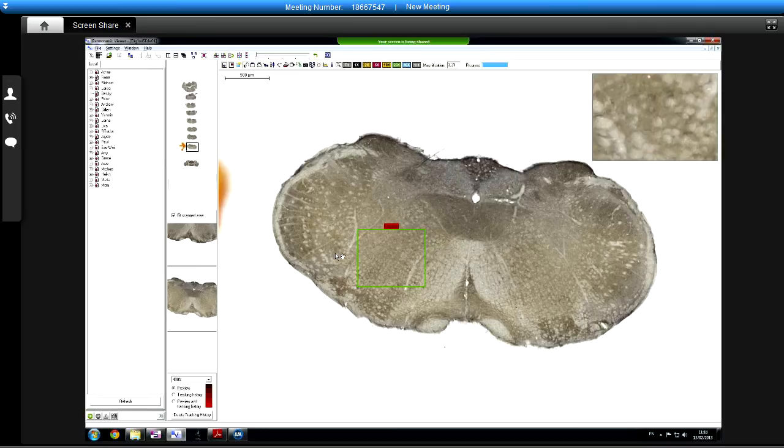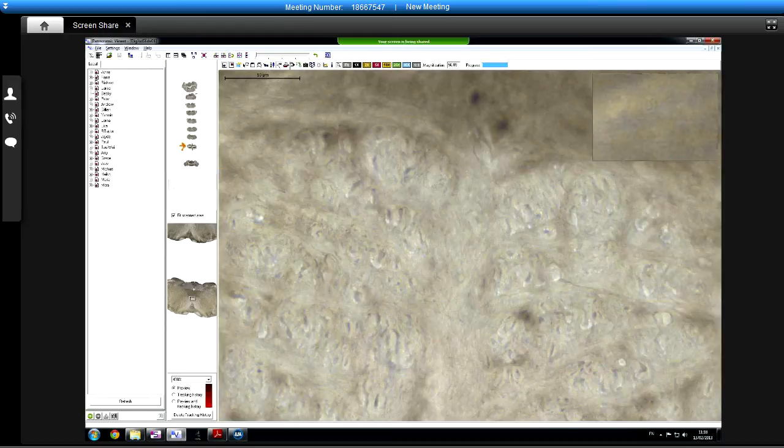So the first thing is, when training histoquant, the recommendation is that when training it and tweaking stuff, you operate on smaller images that are probably no bigger than about 300 microns squared. When you're looking at, say, 1:1, for instance, if I go 1:1 here, I can see if I just select the measure distance tool that across there is about 300 microns actually. So an area about that when you're 1:1 is a good place to start when setting it up. But also, obviously, it needs to be representative.